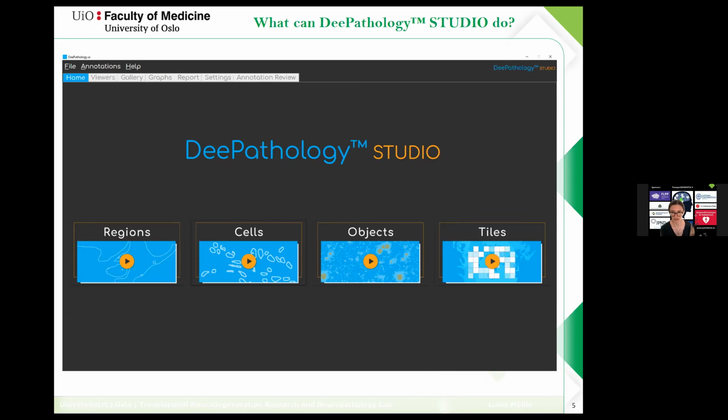You can use the objects mode, which is the most versatile one, and the one we're going to focus on today, where you can basically detect any object, anything that you can see on a histological slide. And there's also the tiles mode, in which your slide is basically separated into smaller or bigger squares, and each one of the squares will then be classified into a certain category.